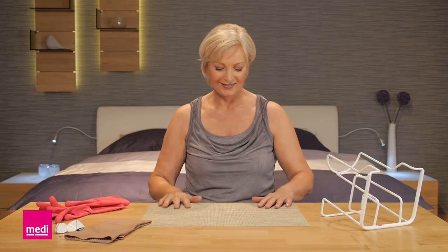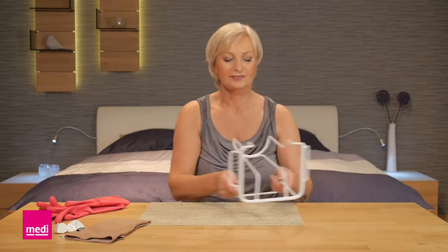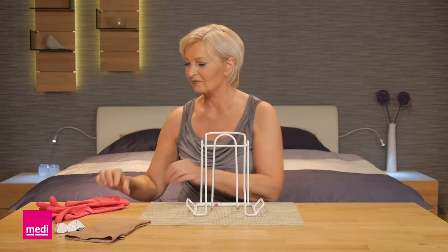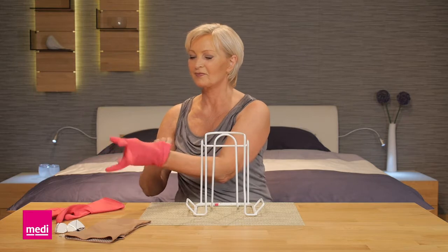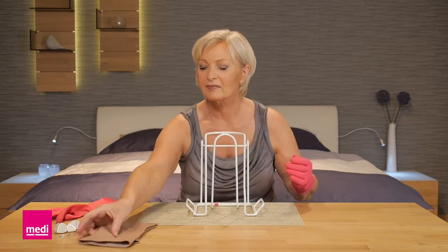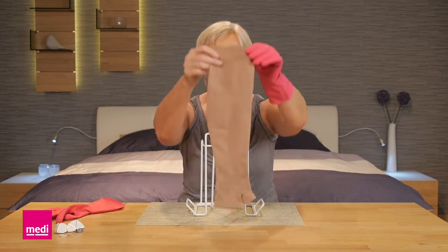Lay a non-slip mat, for example rubberized fabric, on a table and place the Midi Arm Butler on it with the closed side of the base facing towards you and the opening in the semi-circular frame facing forward.